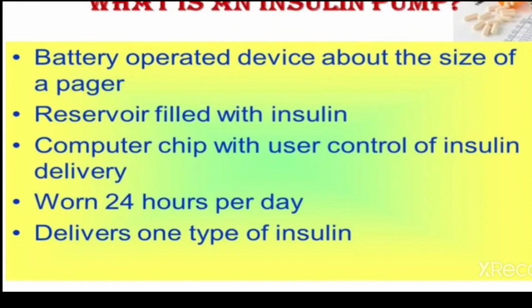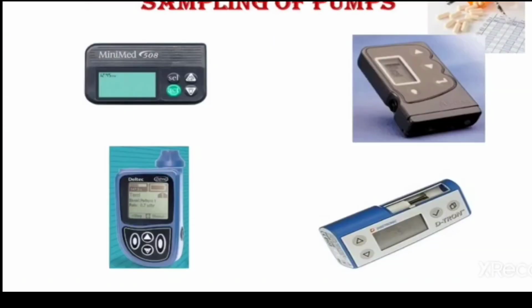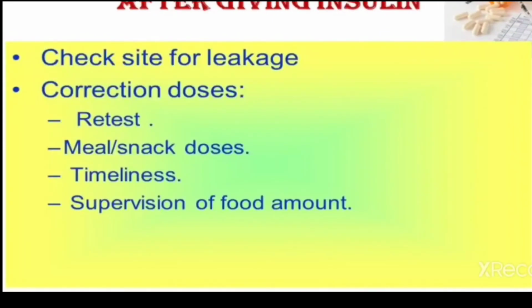And what is the insulin pump? An insulin pump is a battery operated device about the size of a pager, with a reservoir filled with insulin. It has a computer chip with user control of insulin delivery, works 24 hours per day and delivers one type of insulin. This is a sample of an insulin pump.